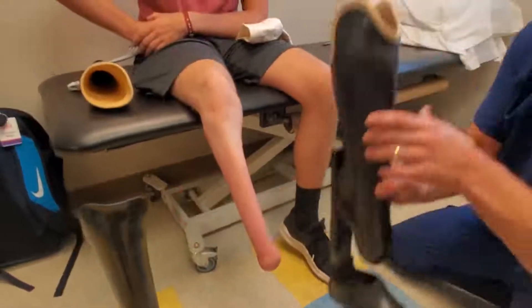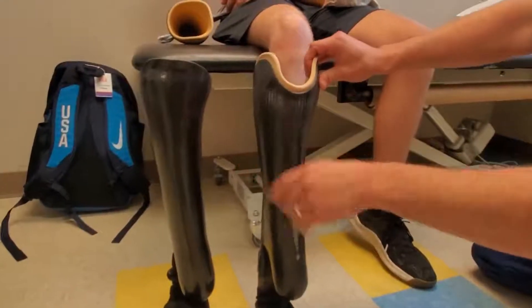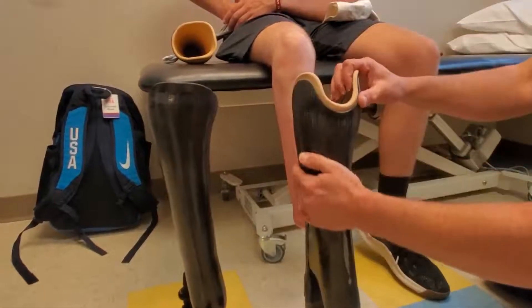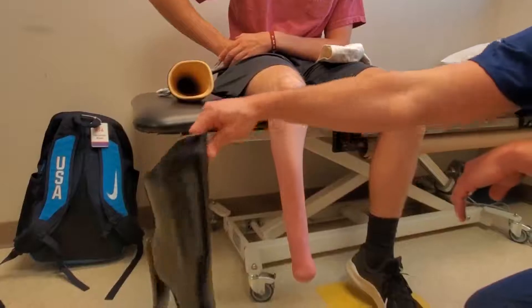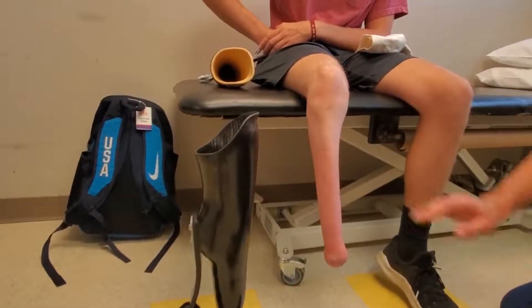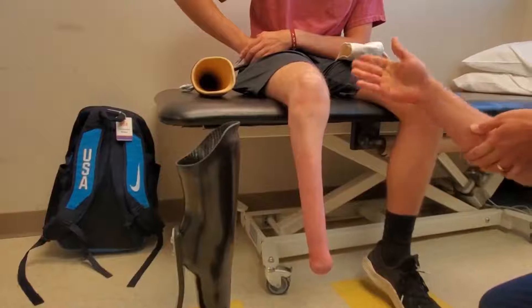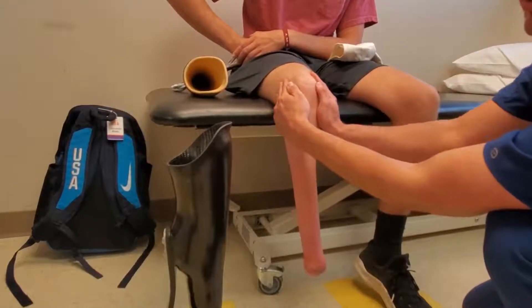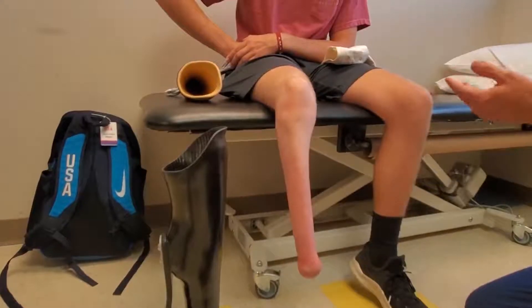As I mentioned, we have different trim lines now. What we like about these lower trim lines is that they free up his knee and the muscles that can control his prosthesis, using his anatomical muscles and bones rather than essentially having a brace around his knee. We performed a varus/valgus laxity test and anterior drawer test to check for laxity, because this trim line is not appropriate for everyone. He has good strength and intact ligaments, so we're able to go with a lower trim line. Anytime you get the patient using their own muscles, putting more stress on actual anatomy, it makes things stronger — promoting bone density and a healthy joint long term.